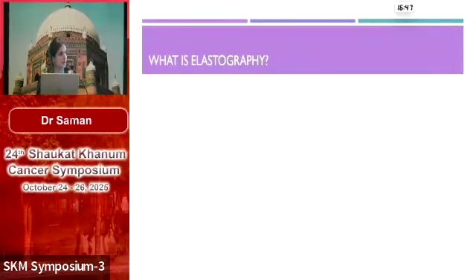Now we know that whenever a patient comes to us with a mass or a large swelling, what do we do first? Before any investigation, we palpate the mass or the swelling. Why so? Because we know by default that a malignant mass is going to be hard and a benign pathology is going to be soft, right? So this principle, that a pathological process changes the stiffness value of the involved tissue, is basically used by elastography.